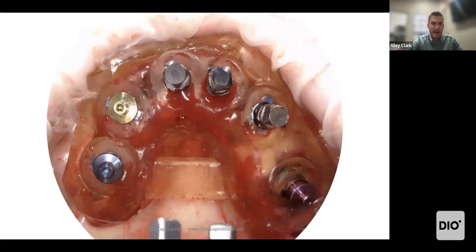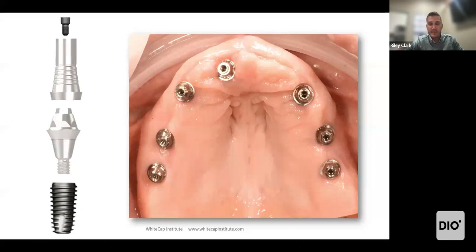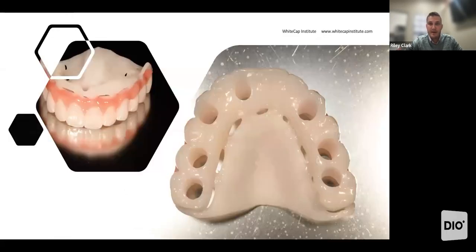From there, you put a guide on, you put your implants in. I'm not going to talk a whole lot about that, just because that's not our topic today. Their workflow is a multi-unit abutment workflow. So the implants will go in, and then you'll place this transmucosal abutment, which brings the margin basically to the gums or just under the gums. And then a temp cylinder is placed. From there, a temporary that has been made from the lab can be used to help pick up the teeth. And so here you're seeing a lab-made temporary with a palatal rest.